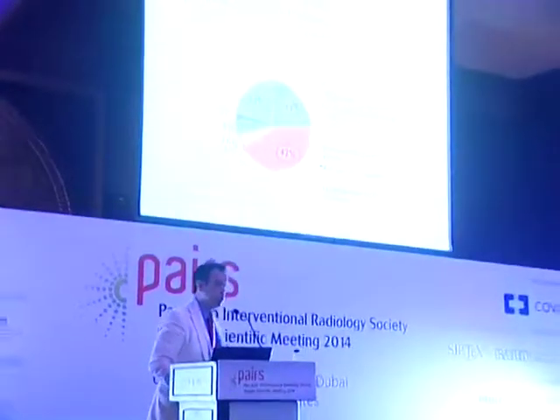What we learned from the Basel trial is that 20% of attempted angioplasty failed because of difficulty of re-entry, perforation, and also difficulty of crossing with the guide wire.